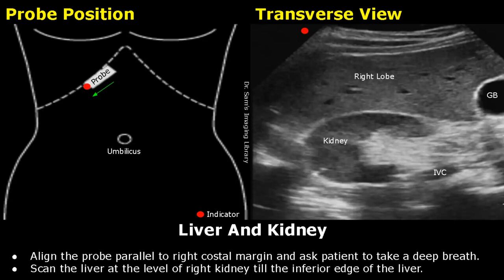There are some differences in individuals regarding actual locations of these organs, so probe positioning and protocols may be a bit different in different patients.